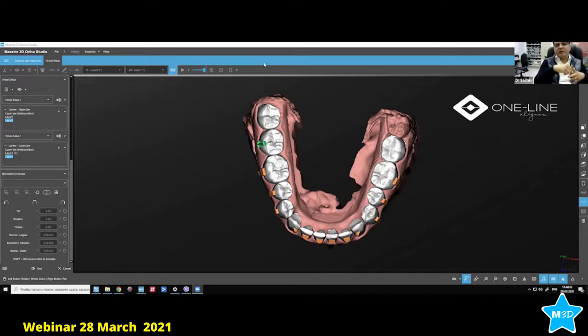So sometimes you might have 0.5, 0.6. I think this question normally appears because the sheet is not flexible. For flexible sheets, this question should not be there. This is only for the sheets which are one layer, single layer. This is what I believe, because I've tried all kinds of sheets, around 7 or 8 different companies. I've seen it maybe only for single layer. For multiple layers, I don't think this is a problem actually.